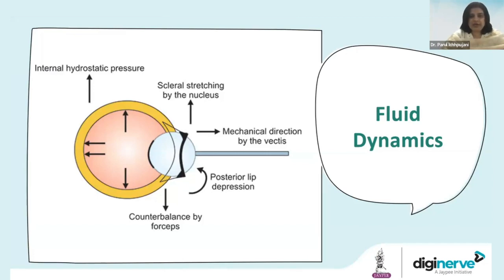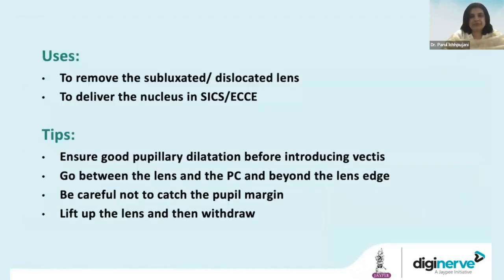If you are struggling, then viscoelastic should be used from time to time, because eventually endothelial cells are going to get damaged if you're struggling too much. So endothelial cell loss can happen, which can lead to postoperative corneal edema. So whenever you're struggling, use a lot of viscoelastic as a buffer between the corneal endothelium and the cataractous lens.